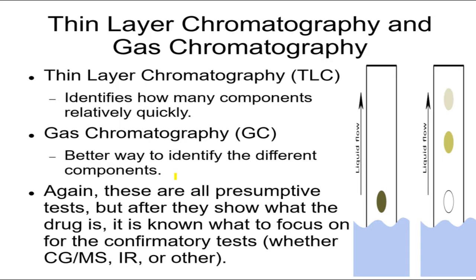So now I know. Now this might not prove it's only heroin. Maybe there's one or two other things that might also come out at the same time, but they know pretty much it's probably heroin. So then they're going to use the mass spectroscopy on it, or infrared. They analyze each component. Let's say this one and this one and this one.